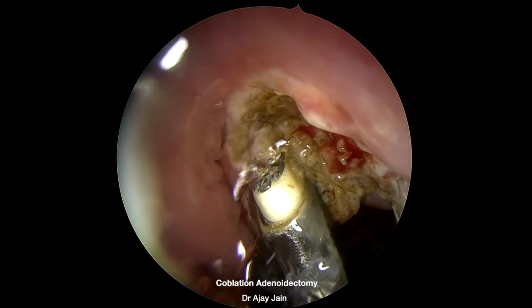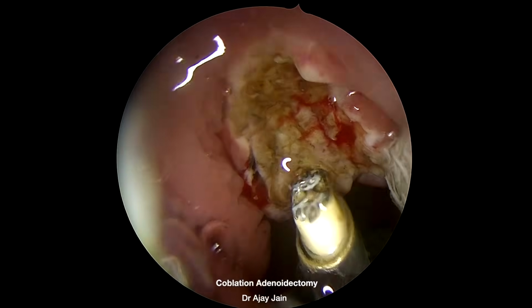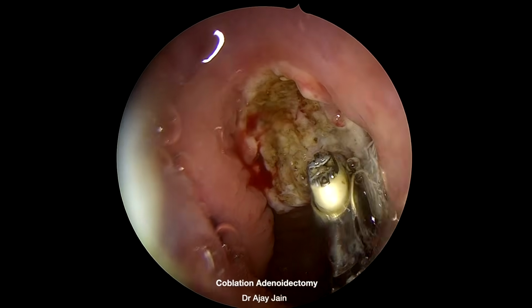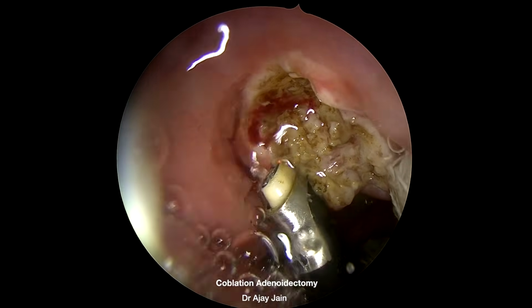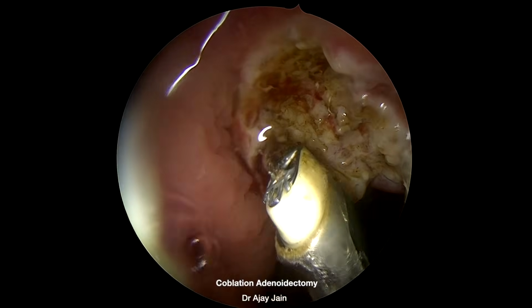In my experience, the Precise Max wand performed better than the EVAC 70 wand of the Smith and Nephew coblation system for adenoid surgery because of its larger suction port. However, avoid pressing the wand tip directly against the adenoid tissue as this can block the suction opening and reduce efficiency.